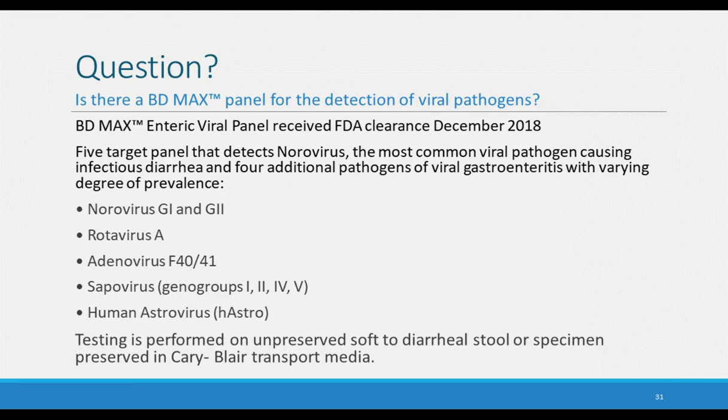I'm very happy to have such a panel because we've been having to send these to reference laboratories for testing. So now we will be able to bring this testing into our own laboratory. The testing can be performed on unpreserved soft to diarrheal stool, or it can also be performed on Carey-Blair transport media.